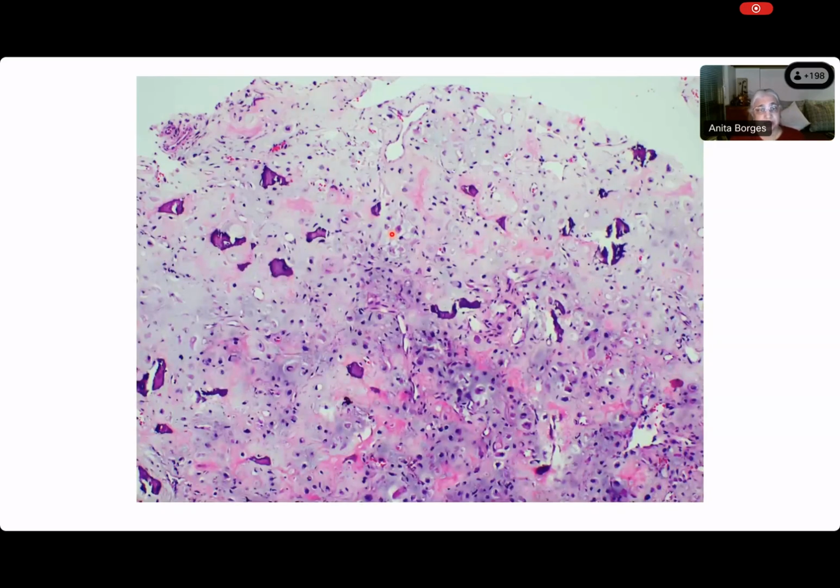Yes. So let's go and see this at higher power. Come on, Sarangi. What are you seeing in high power over here? Here, the chondromyxoid matrix is seen, and some calcified areas, and chondrocytes are present inside the lacunae. Okay, so you see the cellular component of this tumor appears to be chondrocytes. Why do you think that they look like chondrocytes? Because they are present inside the lacunae. Excellent. Yes, they're sitting in spaces that look like lacunae. And when you see lacunae inside a chondromyxoid matrix, you have very little doubt that what you're looking at are chondrocytes.